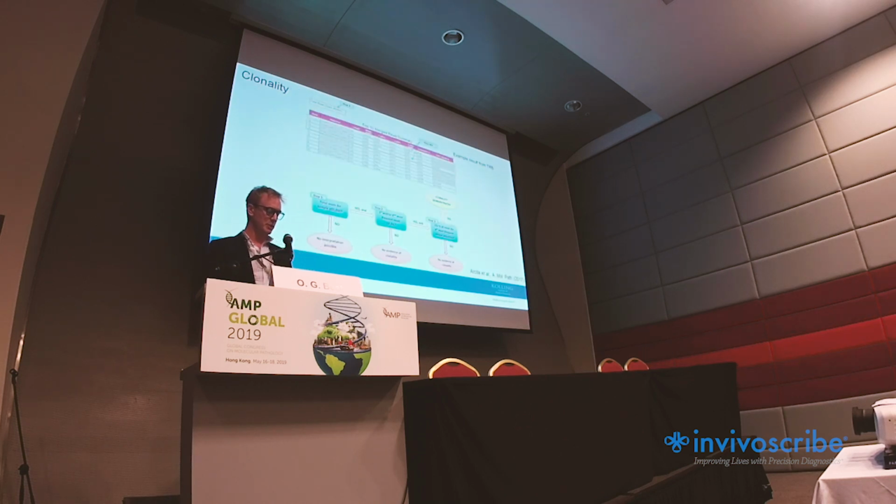So for both the IGH mutational and T-cell clonality assessments, we've used a method that was published by Arcila et al., and we heard just next door, in the last couple of talks, about the use of this, the definition of clonality. Essentially what we did was we looked for greater than 50,000 total reads in the sample.